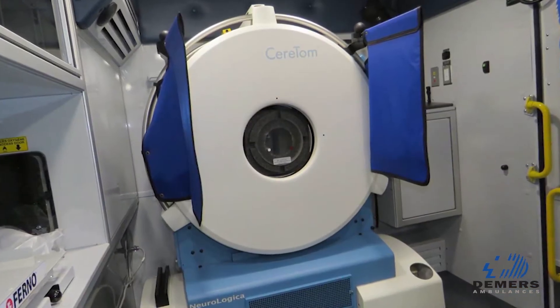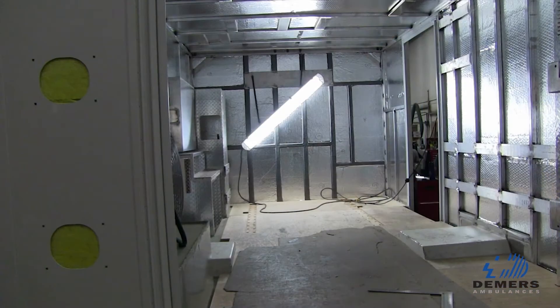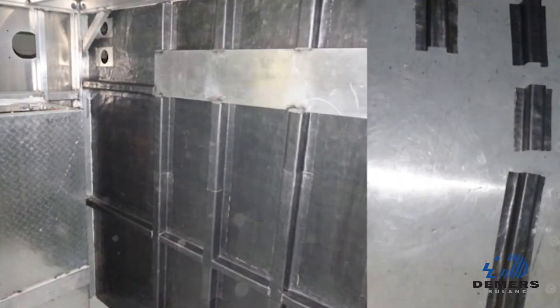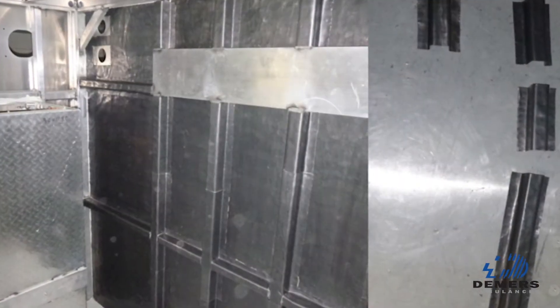As I mentioned before, a lot of the innovation went into what you don't see. Another aspect is the forward front wall is completely lined with lead to protect the occupants in the front cab when the scan is being operated.